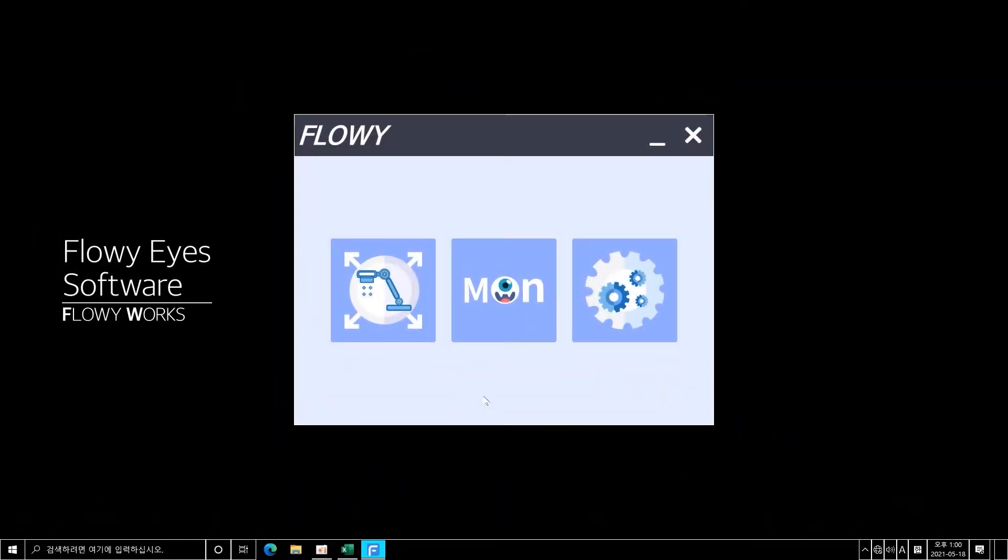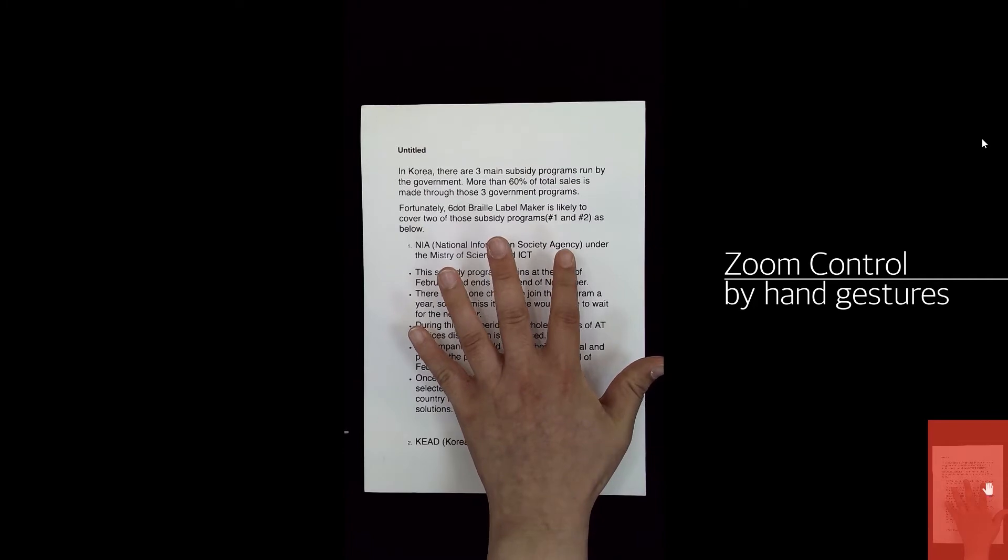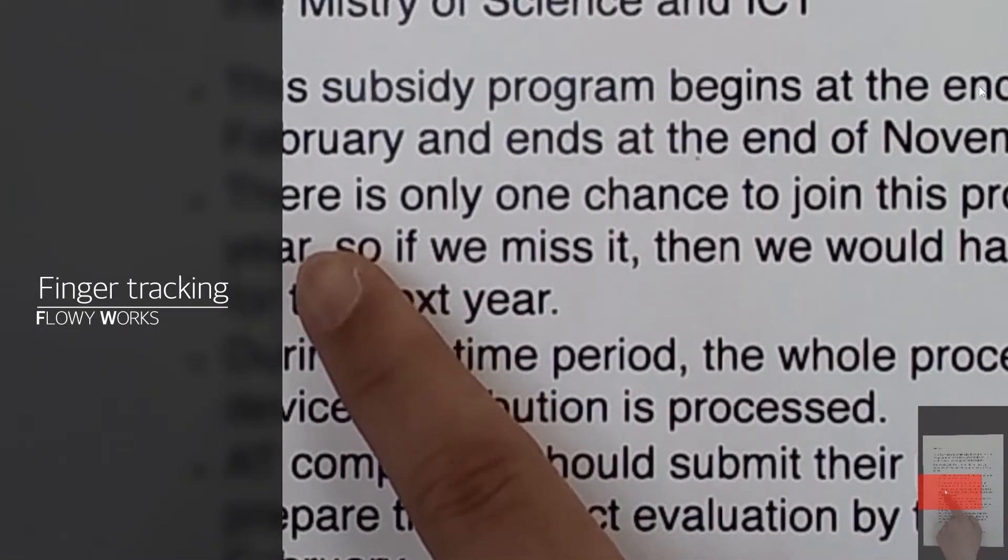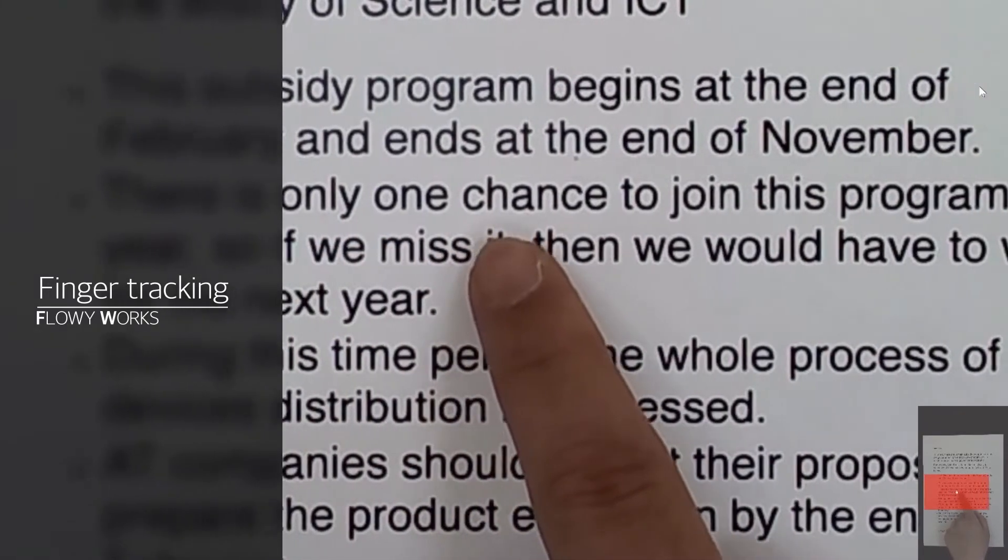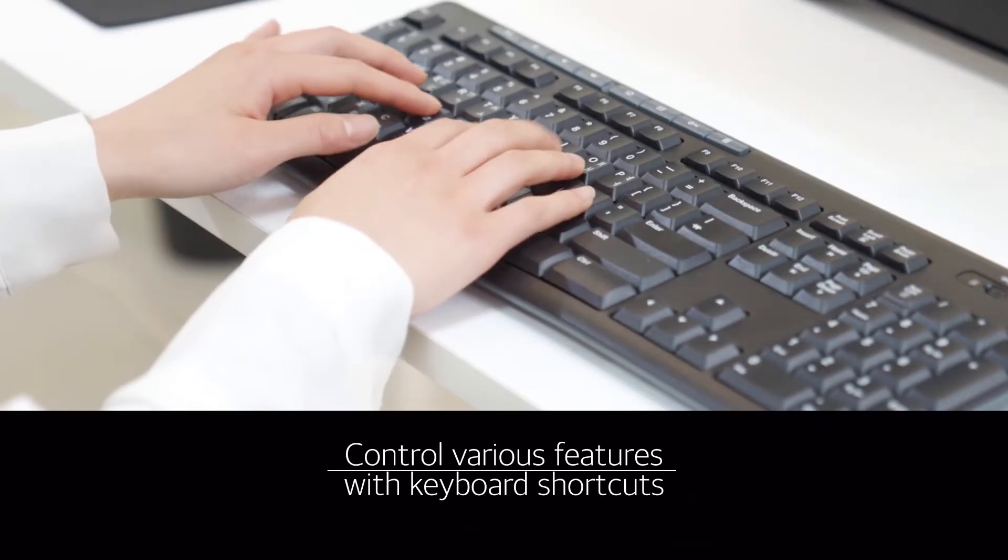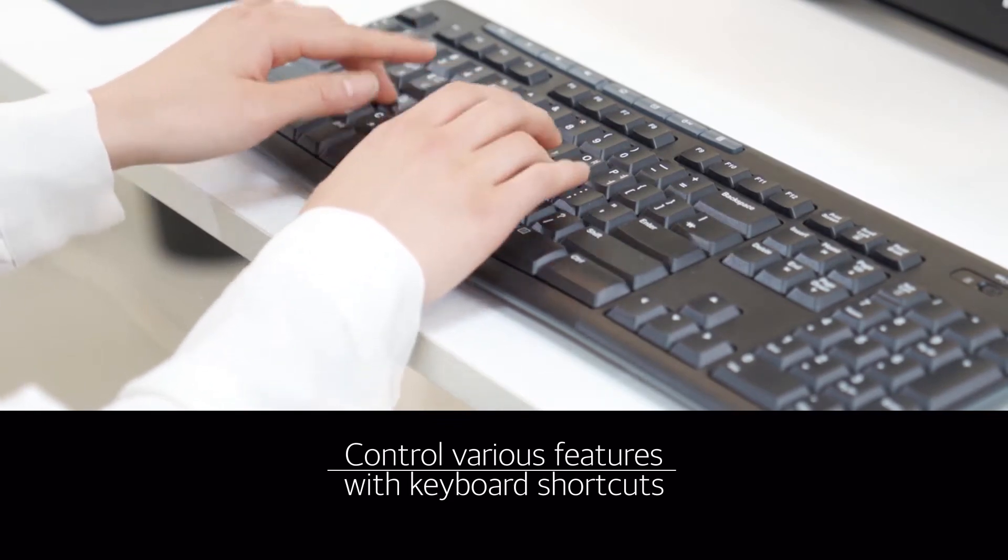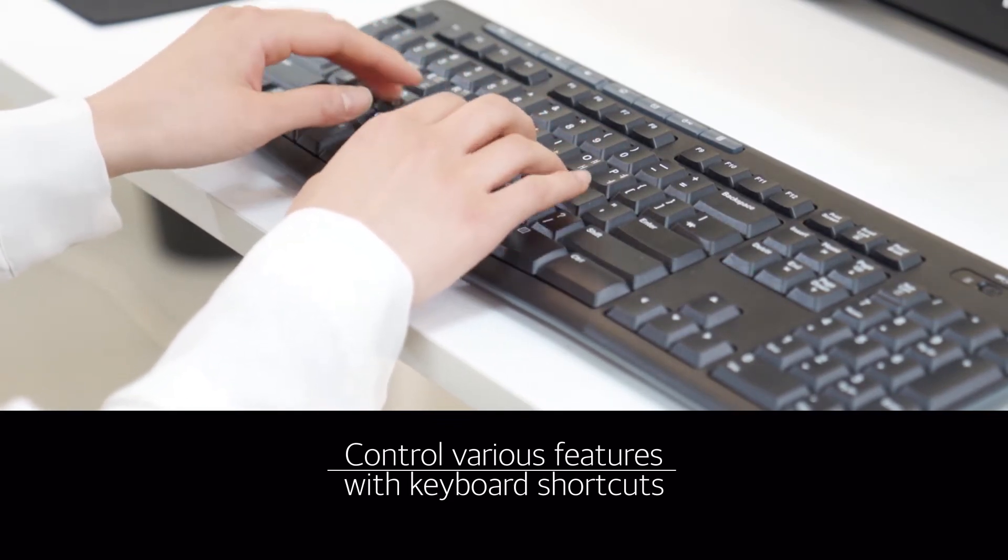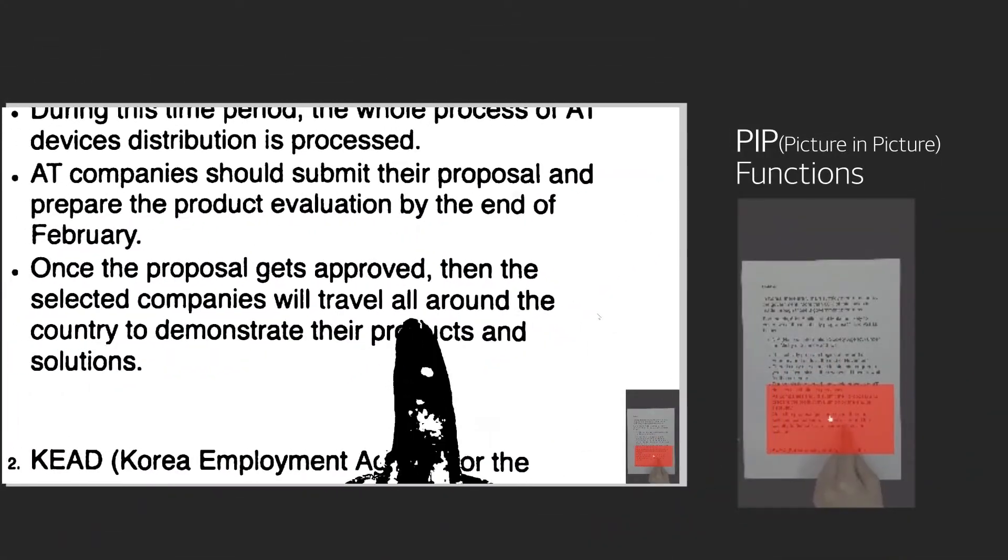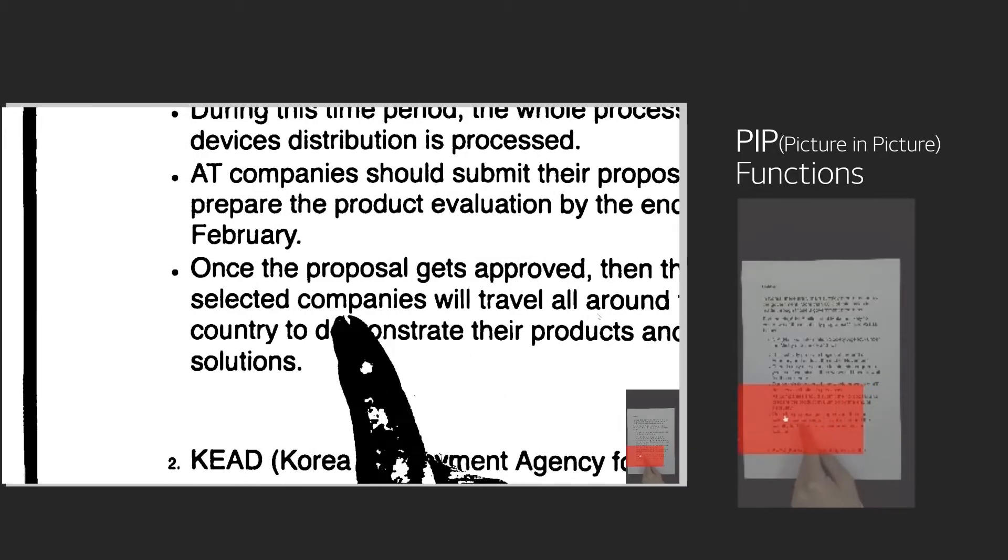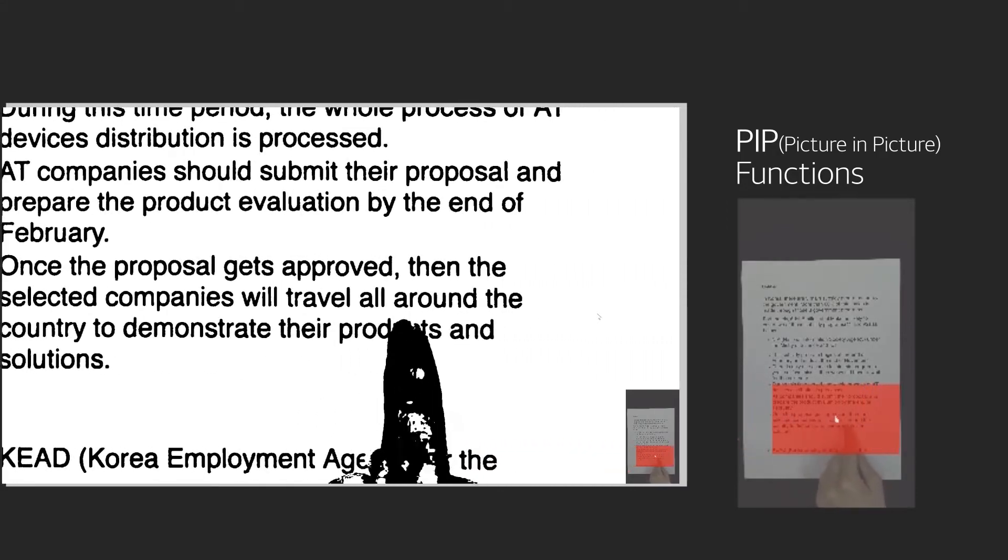When you look at the features of the AI-based video magnification of Flowyworks, it is controlled to zoom in and out by your hand gestures. The AI-based engine automatically enlarges the part which is pointed by your finger and tracks your finger movements. In addition, you can control all the features like zoom in, zoom out, brightness, shade, and high contrast with keyboard shortcuts. A PIP screen is provided on the lower right side of the screen so it helps you to intuitively find the magnified area from the entire image.